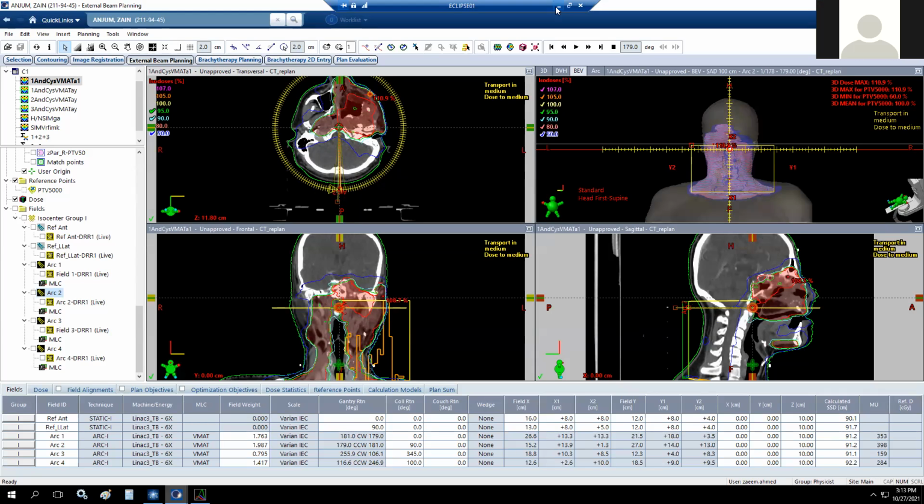I think one-to-one measurements, specifically point dose measurements using independent calibrated chambers and film dosimetry. Have you done those kinds of verifications before relying on the portal dosimetry? Yes, we have done. All right, so the algorithm is doing a good job where there are cavities. Are you happy with it?